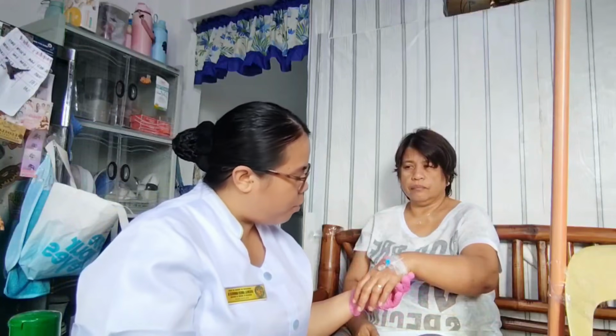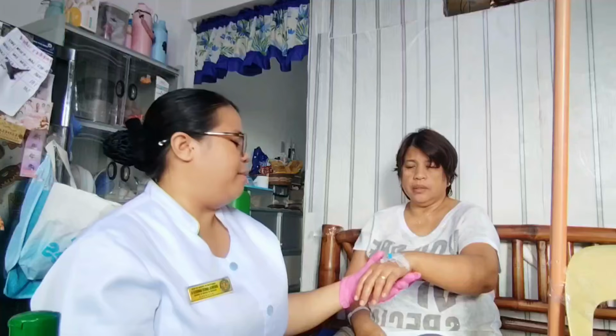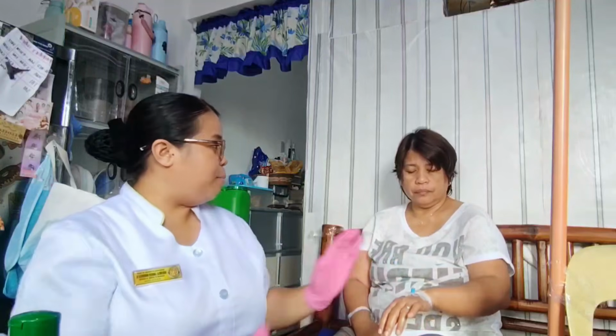Okay, so wala naman pong redness, wala naman pong swelling. May nararamdaman po ba kayong masakit? Wala naman po. Okay po, ma'am. So, magsa-start na po tayo. Ready ko lang po yung gagamitin.